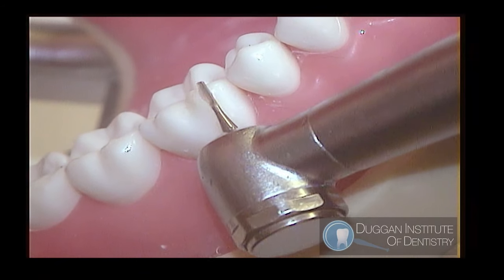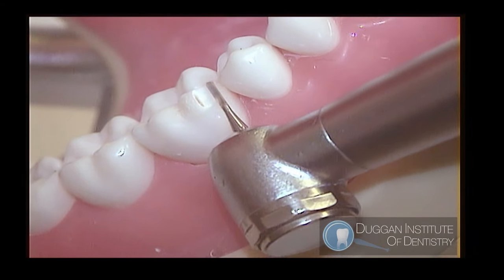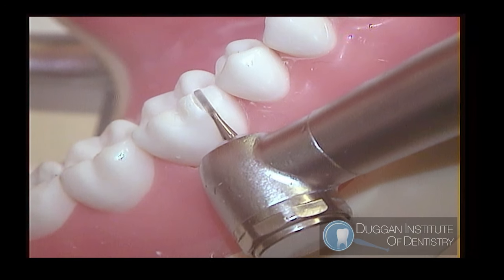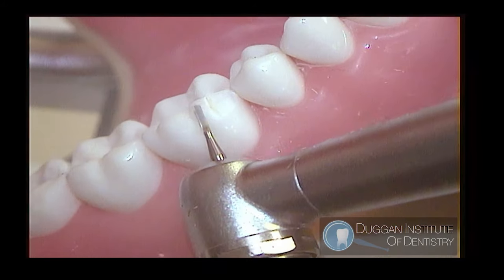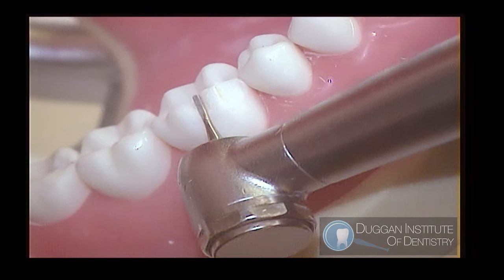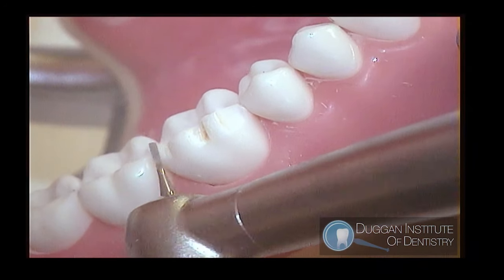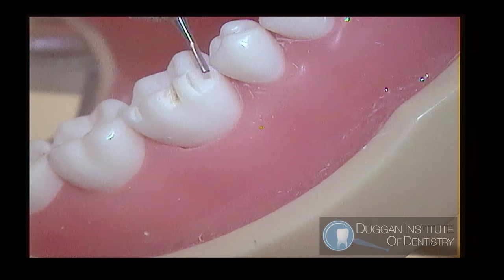Reduction of the functional cusp bevel, also referred to as the A-plane. The functional cusp bevel is located on the buccal cusps of the mandibular teeth. The bevel, or A-plane, is approximately 3.5 millimeters wide, extending gingivally from the tip of the cusps to the occlusal 1/3 of the buccal surface.